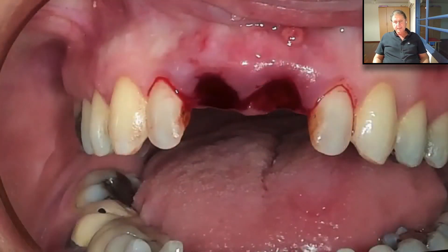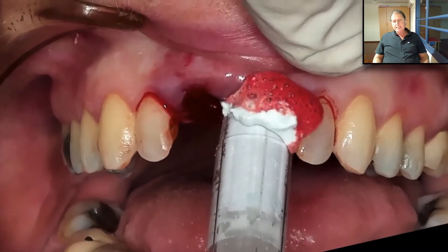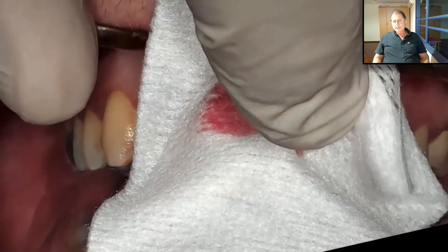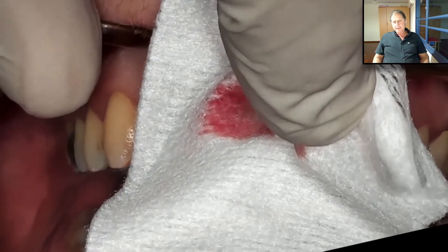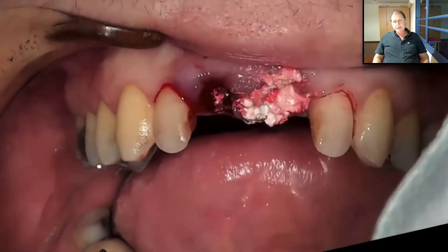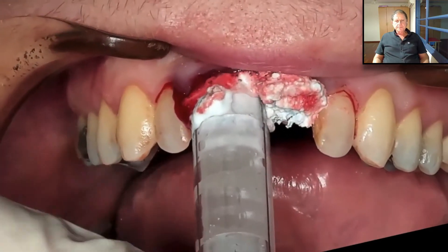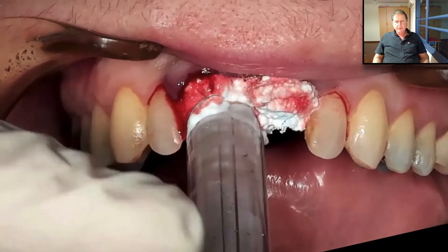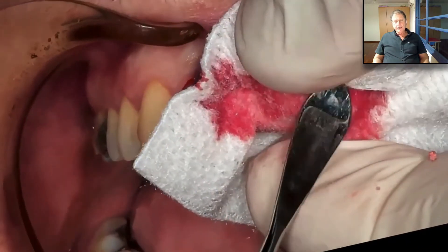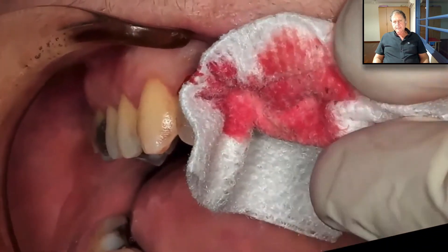There is no buccal plate here. We take the Bond Apatite, activate it, and inject it into the site. If we don't have a buccal plate, it's very important to compact the material well all the way down in order to fill the buccal defect. We do it with a gauze, first pressing with the finger, then pushing down with the periosteal elevator on a gauze, and we slightly overfill. We fill the other socket, press again with the finger for three seconds, then take a periosteal elevator on the dry gauze and add additional compaction for two or three seconds.